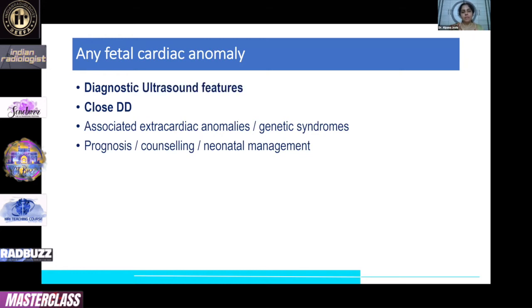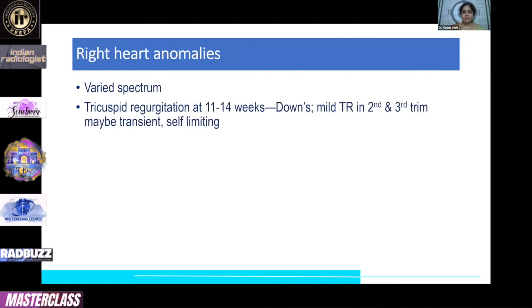So we will mainly concentrate on the diagnostic ultrasound features, the close differentials, and of course the associated extracardiac anomalies and the genetic associations.